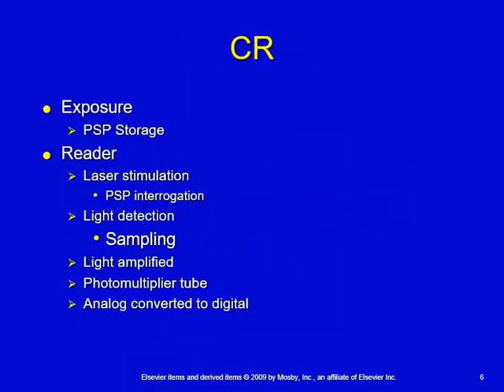So in CR, again, what we have is exposure to the plates. The PSP plate, the photostimulable phosphors are inside of the plate, and if you remember, in exposure they glow and they emit a little bit of light, but they don't glow as much as intensifying screens do.